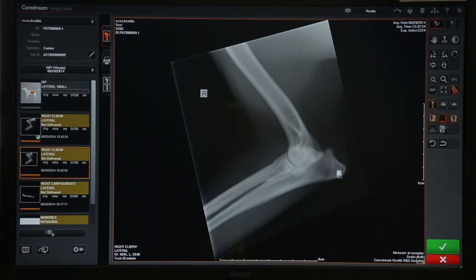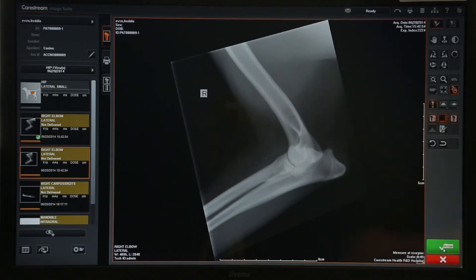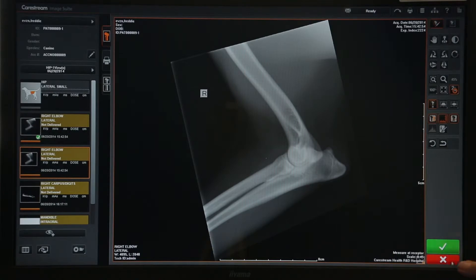At this point if you're happy with the picture you can just hit accept and that will save the picture — it will develop a green tick on it as can be seen on some of the others. Alternatively if it's a bad picture you can hit reject and that puts a red cross by the picture, but don't worry — if you do reject a picture you can always unreject it if you need it back.